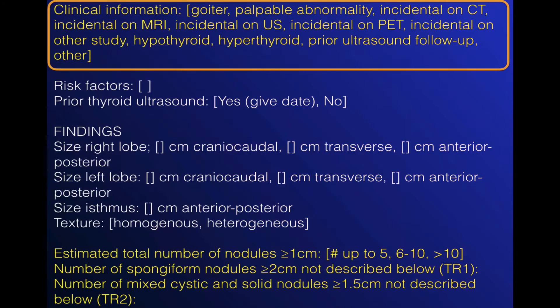First, let's take a look at thyroid ultrasound. The report starts off with clinical information — the reason the patient had the ultrasound — and this is a pick list option. Next we've got risk factors, prior ultrasound, and a general size and texture of the thyroid. The white font is optional but makes a complete radiology report; it's the yellow font that is really important for the study. The last part of this early section has three lines on nodule numbers. The first line is the estimated number of nodules measuring one centimeter or greater — you can count up to five, then just give ranges. This is for all nodules of any composition, whether or not you've reported them in detail below.